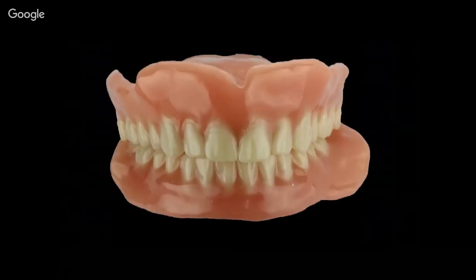Now you're probably wondering how I got that so shiny. Well, one of the things you can do that's kind of cool is, anytime you print an object, if you look really closely, you can see the little ridges from the layers of printing material, right? To smooth all that out, you could pumice it and spend an hour trying to pumice away those little ridges. But what's a lot easier is to take a wet finger, stick it in the wet resin, and just rub that resin in.